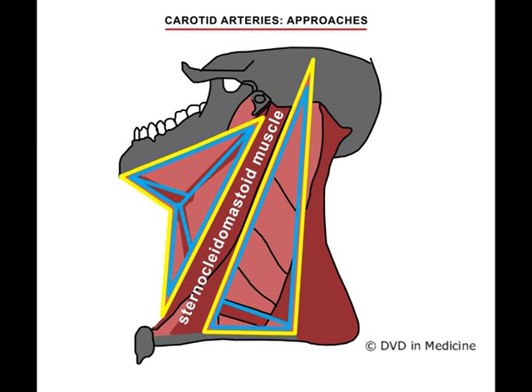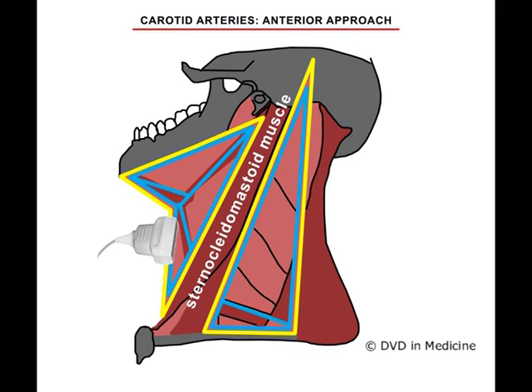It may be necessary to try a variety of scan planes in order to see the bifurcation in some patients. One should use all three mentioned approaches. Anterior approach.